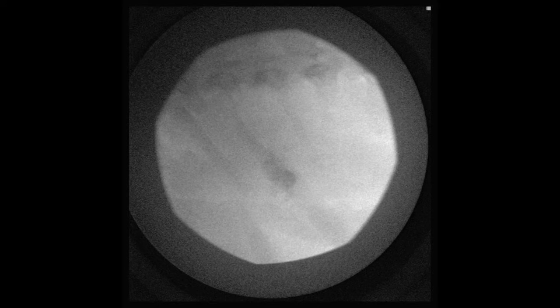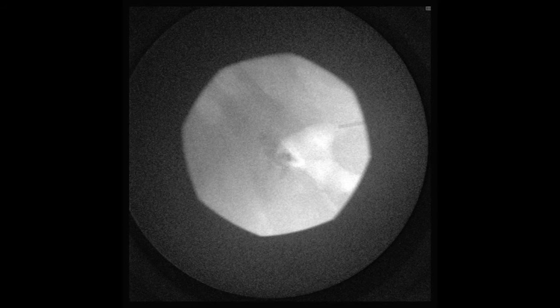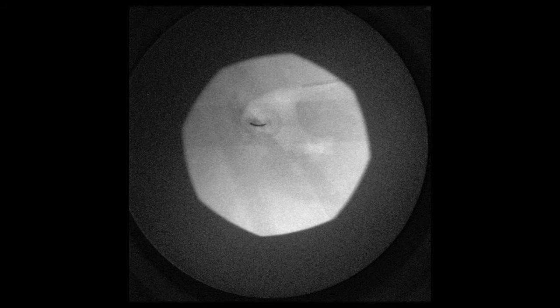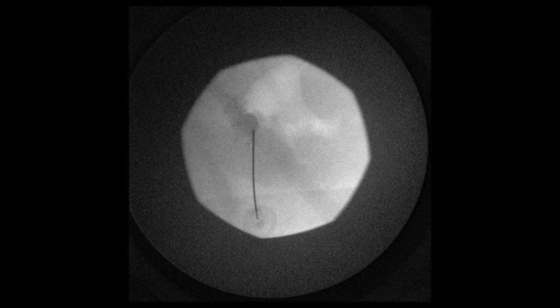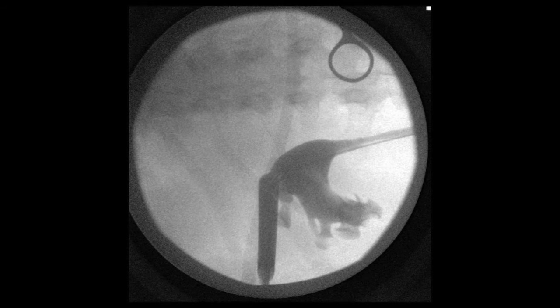I'd just like to highlight what an excellent agent air is to use for your contrast during PCNL. Not only does it float posteriorly to highlight the posterior calyces, it allows you to use less radiation because it's less dense than contrast. And finally, when you aspirate your syringe after access, it's obvious if you're in the right place if you've aspirated air.